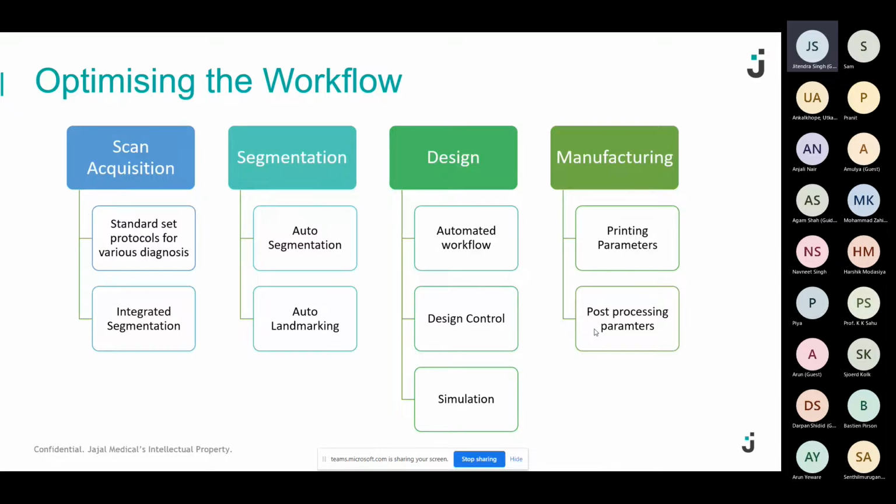When it comes to understanding the capabilities, durability, longevity of the implant, or how this implant would be manufactured, a lot of simulation comes into play when you can do the strength test analysis, the fatigue failure analysis of the implant, maybe directly in the design. The softwares can also predict where it would actually fail, either during the printing or after the implantation, or because of some reasons. So when we really incorporate these kind of things into our flow, it becomes much easier and much more efficient.